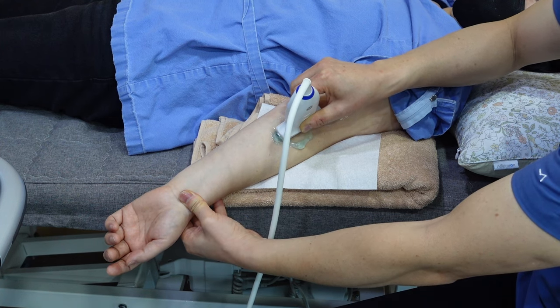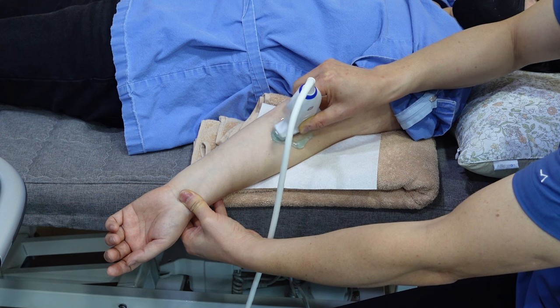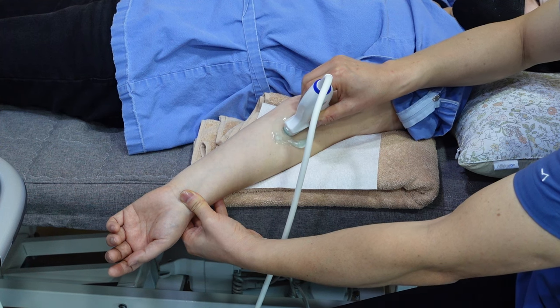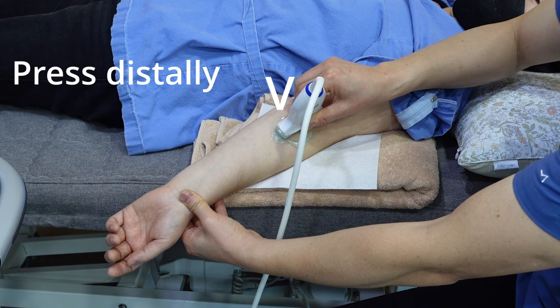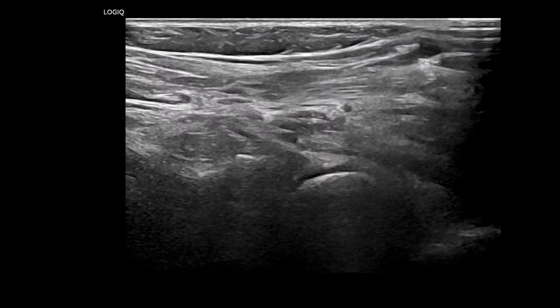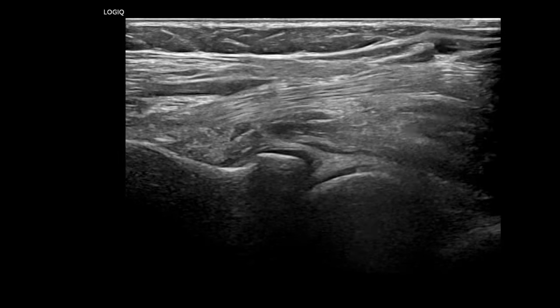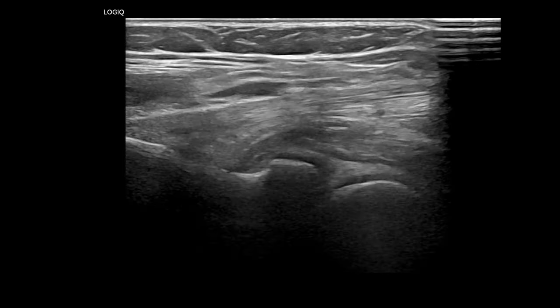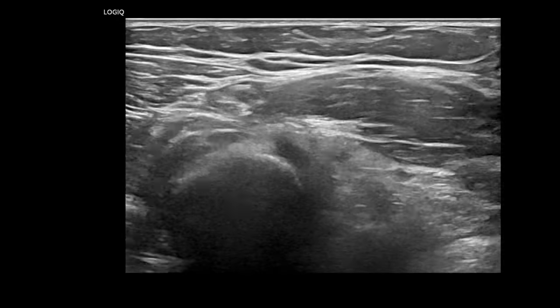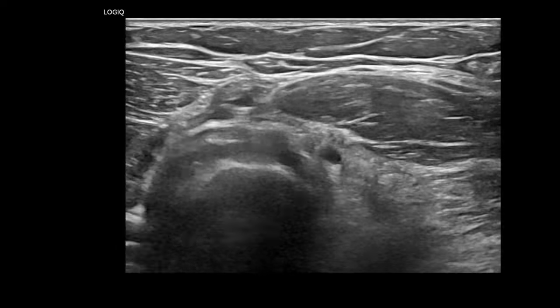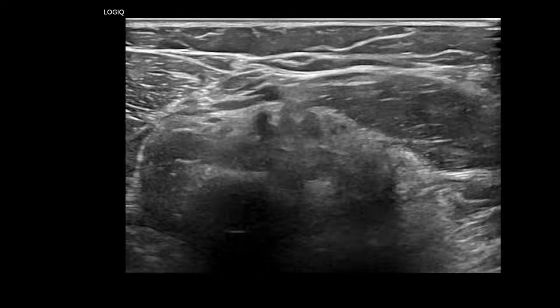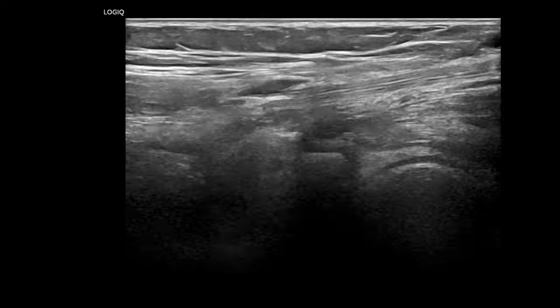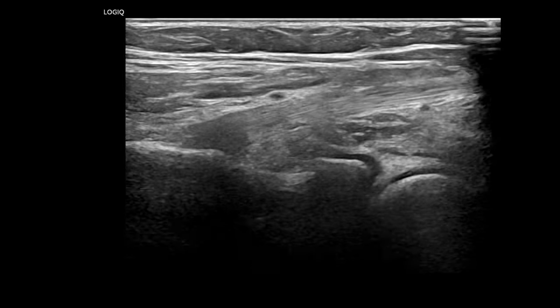This positioning helps bring the tendon's insertion at the radial tuberosity into view. Correct ultrasound transducer orientation is vital to avoid anisotropy, requiring the distal half of the probe to be gently pressed against the patient's skin. This maneuver ensures parallel alignment of the ultrasound beam with the distal biceps tendon, allowing adequate visualization of its fibrillar pattern. The long axis view is preferable for examining the distal biceps tendon, as short axis planes are less effective due to dramatic variations in tendon echogenicity with slight probe orientation changes. Both the radial tuberosity and the bicipitoradial bursa should also be examined.